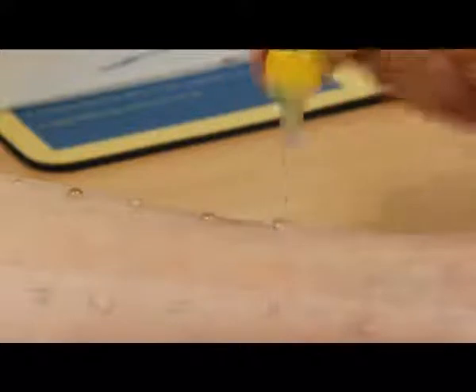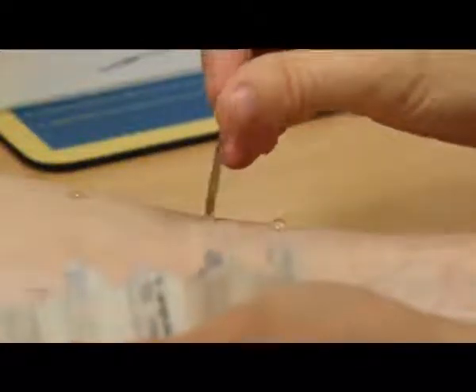Unless you react to the negative, which is rare, but some people do. And again the same on this side, just a little twist. And again we'll just blot that side, and then we'll sit and wait. You can move your arm now.